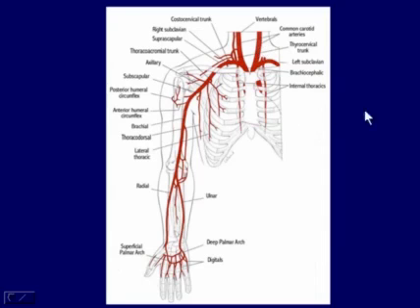In terms of looking at the upper extremity, large vessel upper extremity disease is pretty rare. Probably less than 5 to 10% of our patients will be evaluated for disease, say, involving the subclavian, axillary, or brachial arteries up and through here. We see a lot more evaluation of the upper extremities nowadays prior to use of the radial artery for CABG or prior to the creation of an AV fistula, which we'll talk about in a little bit.